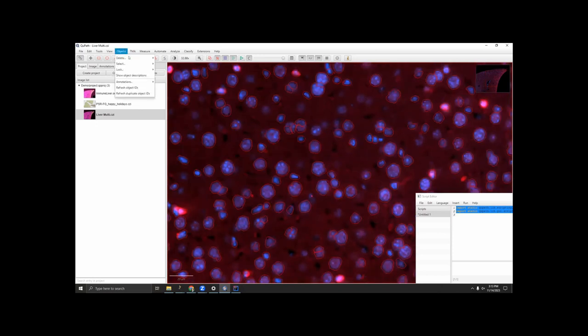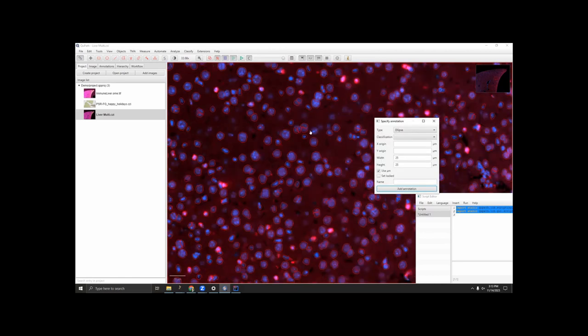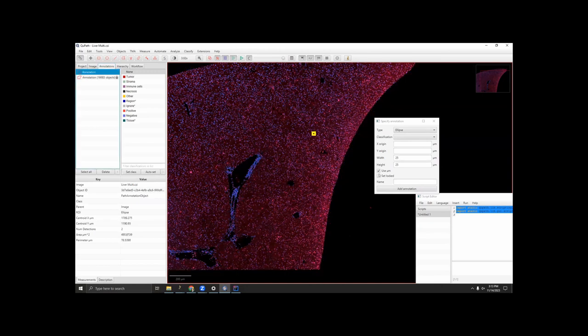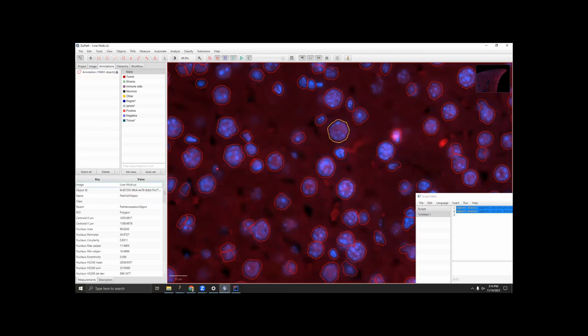So to demonstrate, what this does is it draws a circle. That's micrometers. 25 microns. So it effectively calculates the average intensity in this region and assigns it to the cell in this region, and so on. And now in every cell we can see in the annotations tab that we have, first of all, measurements of the mean intensity in every channel that came by default in cell detection, and then also mean intensity in all the channels in a circular region.